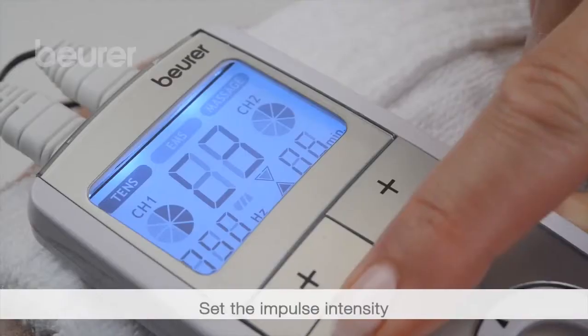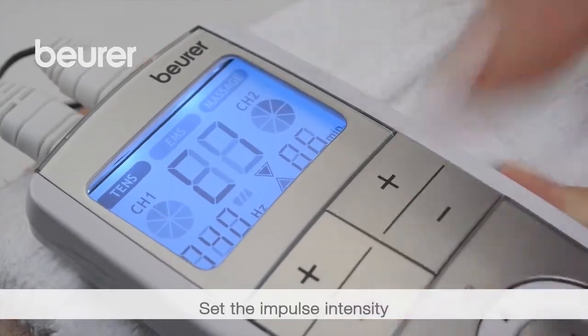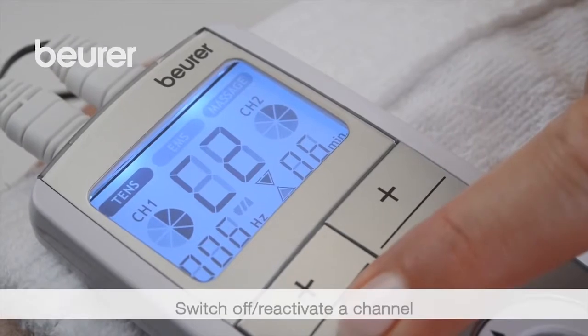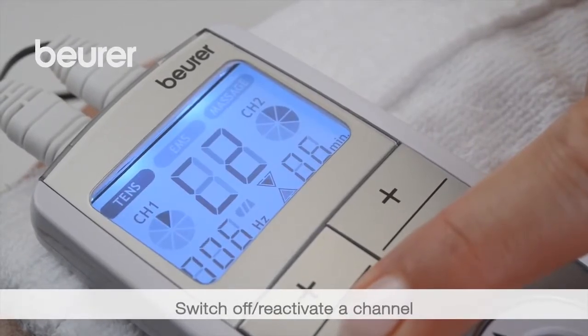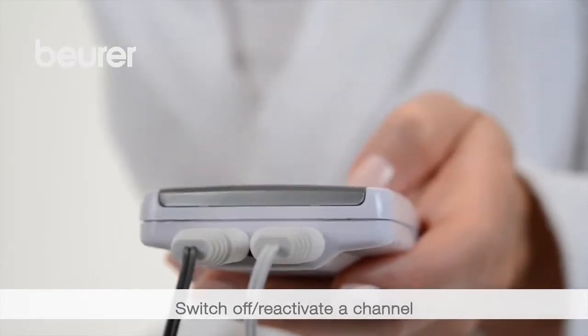Select the impulse intensity for channels 1 and 2 by pressing the relevant plus and minus buttons. To switch off a channel, press the minus button until the lowest level is reached and then keep the button pressed. Press and hold the plus button to reactivate.